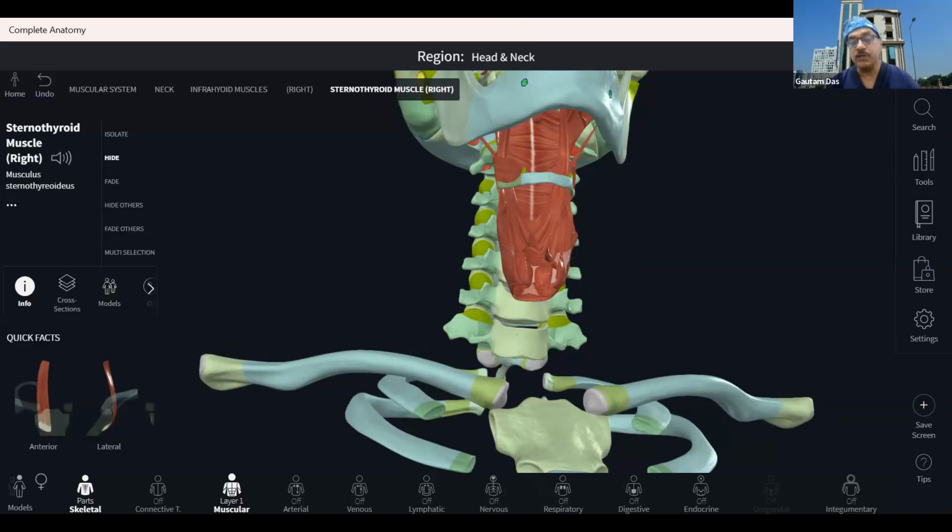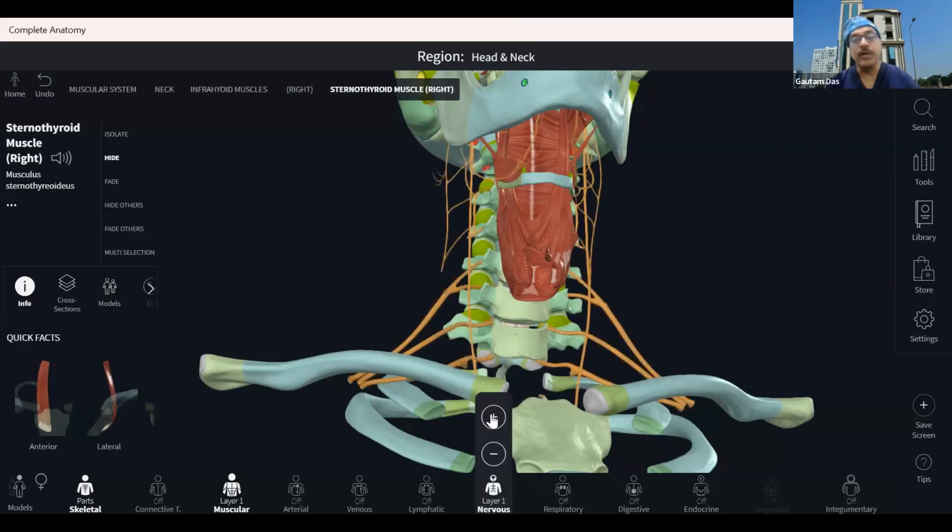And if we add the nerves now, when you're seeing the cervical nerve roots, all of these will have different nerve roots. The transverse process here will be C6, so this will be the C6 nerve root, this will be the C5 nerve root, this will be your C4 nerve root. In that way, you have to remember that in the cervical area, the nerve root of the same level comes just above the transverse process. Also, another nerve root, C8, is visible, which will be below C7. So if we go above, starting from C6, we'll be able to identify each nerve root, and also below, the two nerve roots C7 and C8.